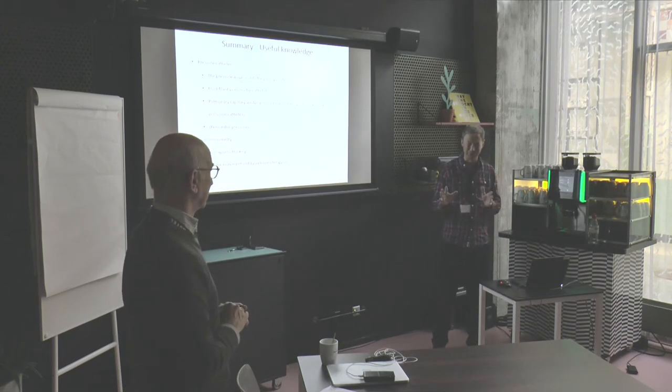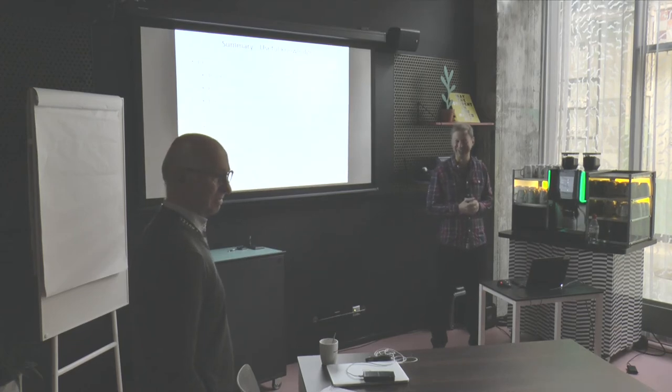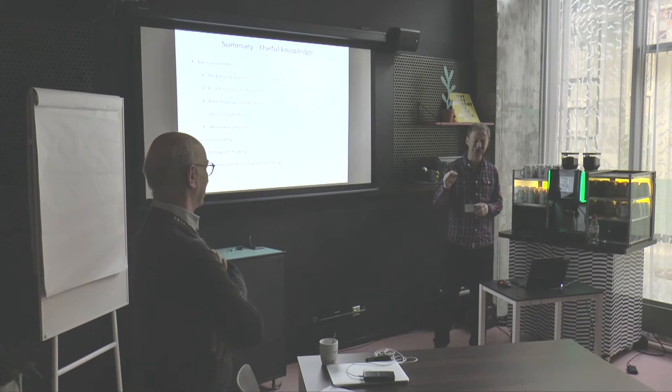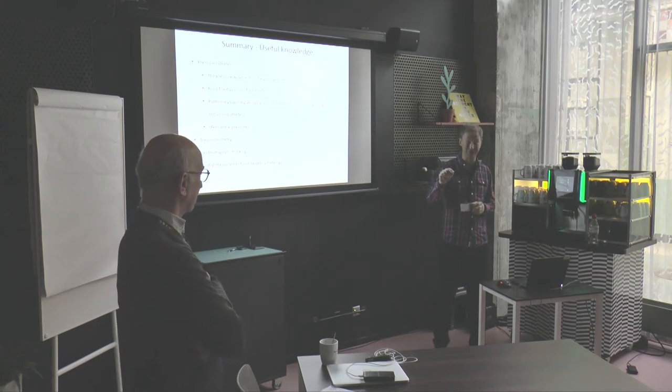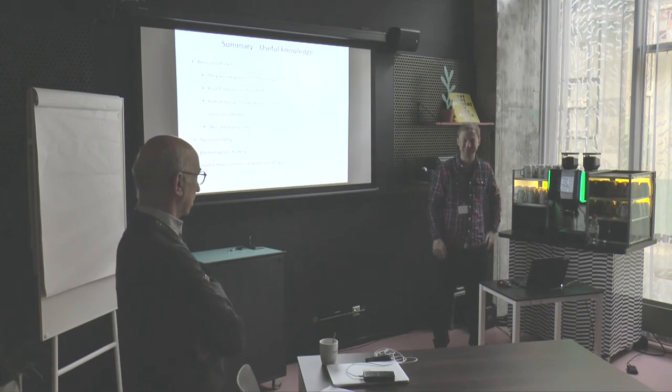Okay. We'll see that. Maybe that's your question. Okay. Yeah. Or you won't have two of them, so you can really measure shortly. Yeah, so you measure the acceleration at one point of the heart, at that time, yes. You don't have a deformation, you just have a motion, yes.